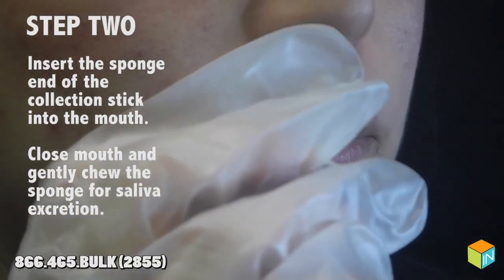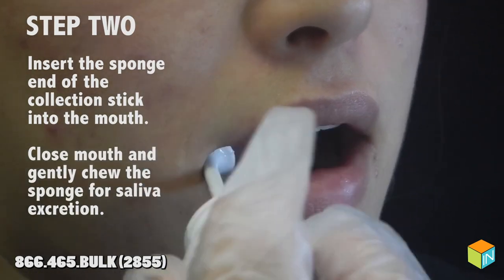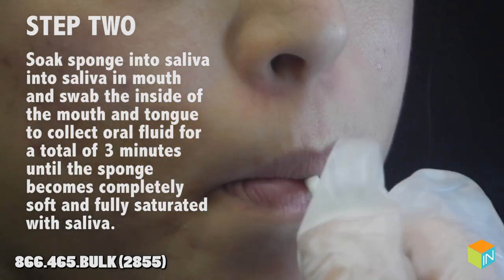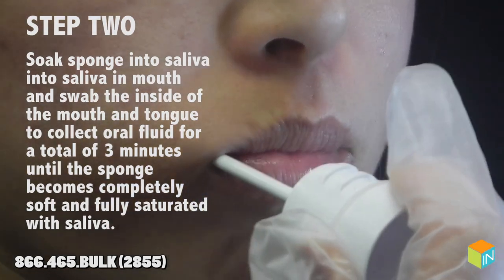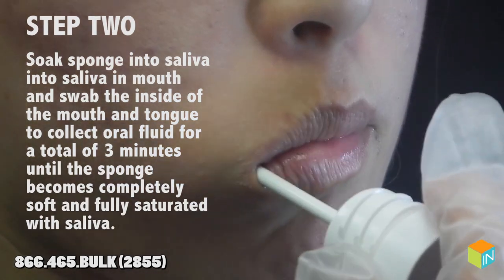Step 2: insert the sponge end of the collection stick into the mouth. Close mouth and gently chew the sponge for saliva excretion. Soak the sponge into saliva in the mouth and swab the inside of the mouth and tongue to collect oral fluid for a total of 3 minutes until the sponge end becomes completely soft and fully saturated with saliva.